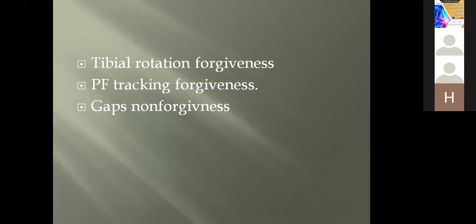But patellofemoral tracking forgiveness, again, is related to the previous point. If you have an abnormal TT-TG distance and you have some confusion adjusting the rotation, this rotation of the polyethylene on the tibial base plates is forgiving for the patellofemoral tracking during the operation and for the proprioception of the patient postoperatively.